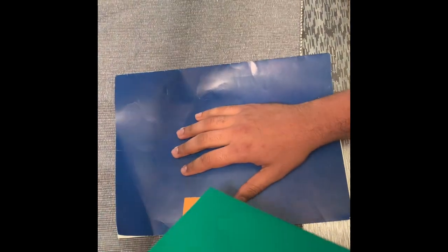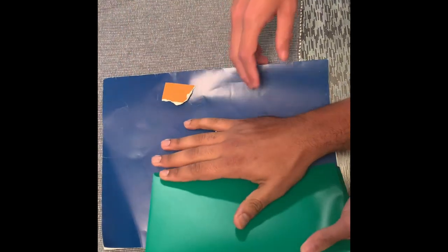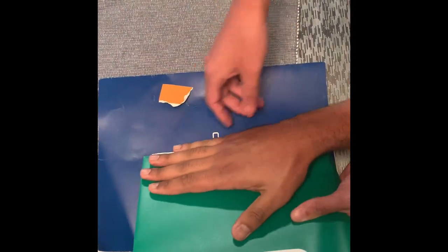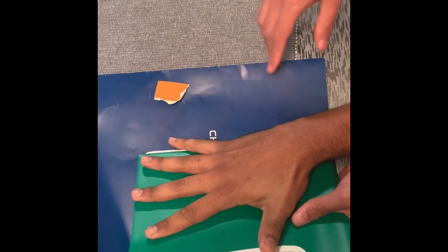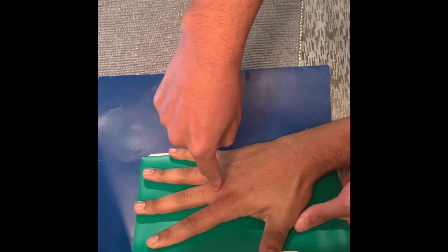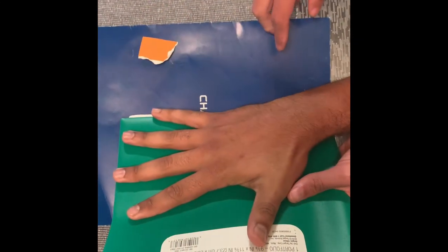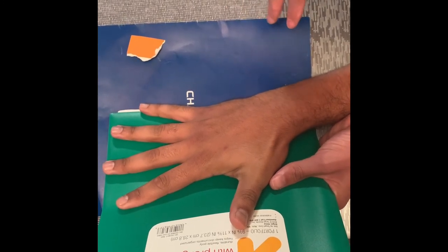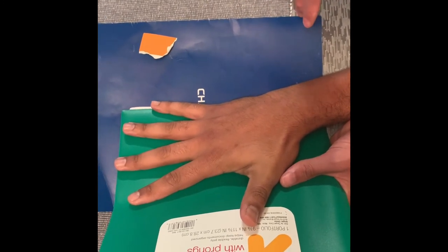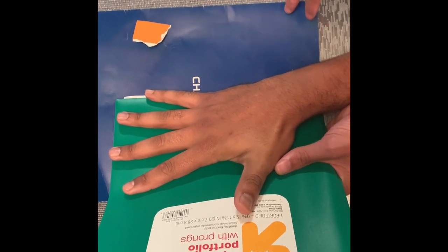Now we're going to do the oblique hand. We're going to need a device that can give us 45 degrees of the hand. I'm going to put the marker here. Can you expand the fingers like this? The central ray is going to be directed perpendicular to the third metacarpal joint. The anatomy demonstrated is going to be the oblique projection of the carpals, metacarpals, phalanges, and the inter-articulations of the hand, and the distal end of the radius and ulna.